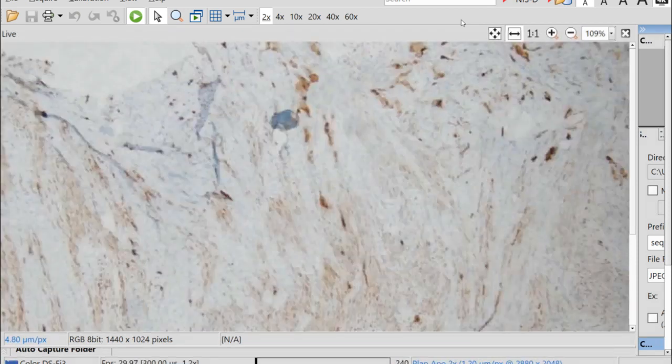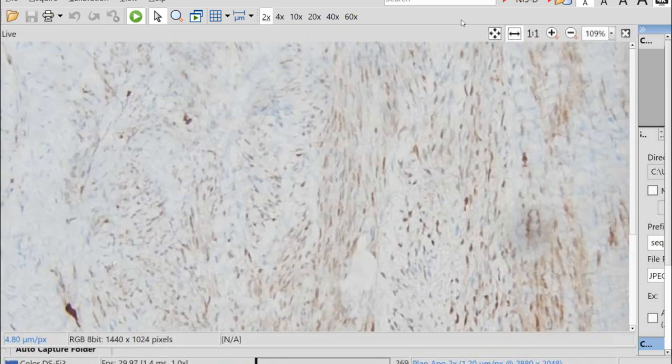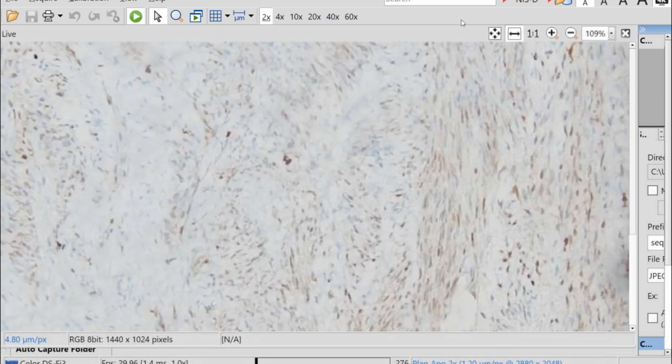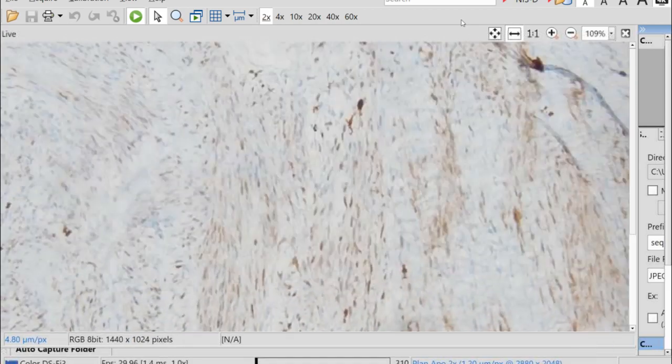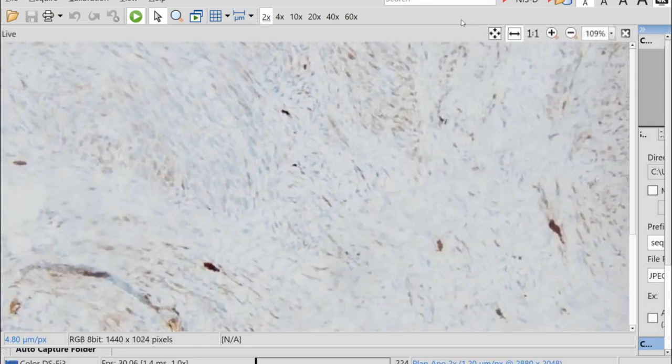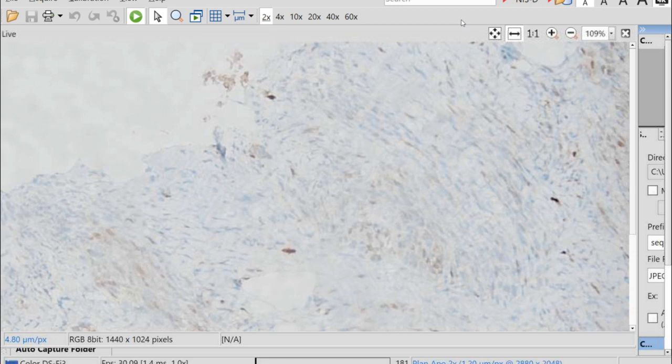This is S100. This is more typical of what you see in MPNST. You have some, which is helpful in recognizing these tumors as being Schwannian, but you have loss. This is not what you see in a schwannoma or a neurofibroma. You have significant loss of S100 in a Schwann cell neoplasm, of course. That is something that is very worrisome. You don't always see it in the lower grade MPNSTs that sometimes develop in neurofibromatosis type 1 patients. You may have preservation of S100, but when you have loss like this it is something very worrisome.